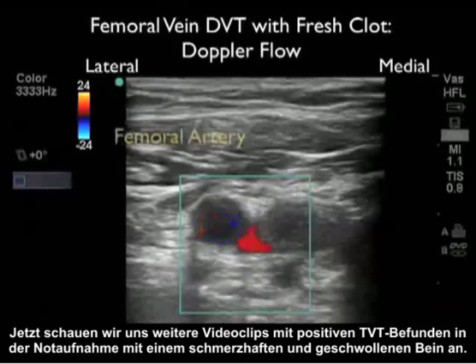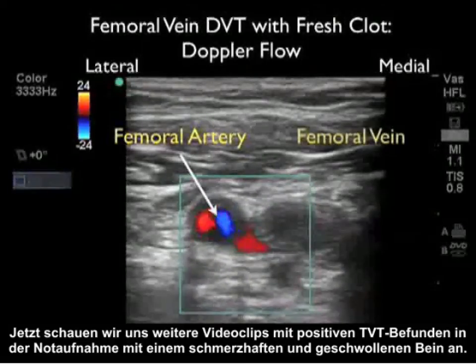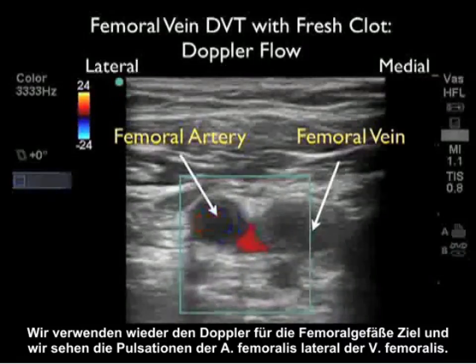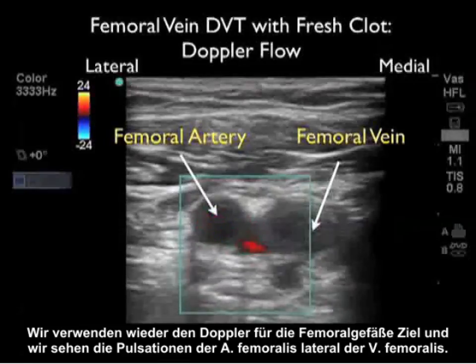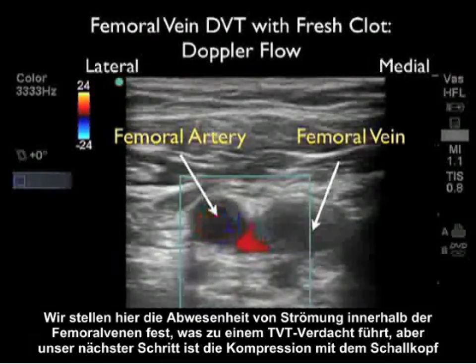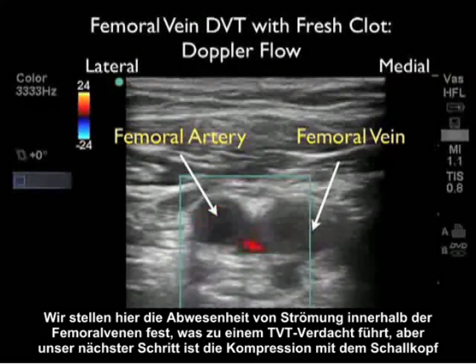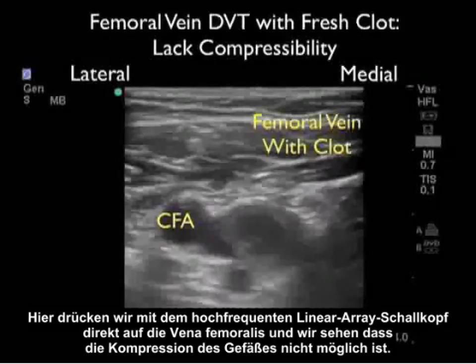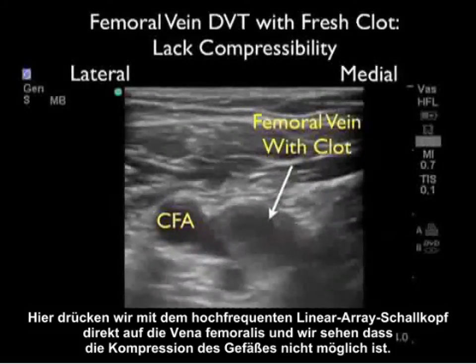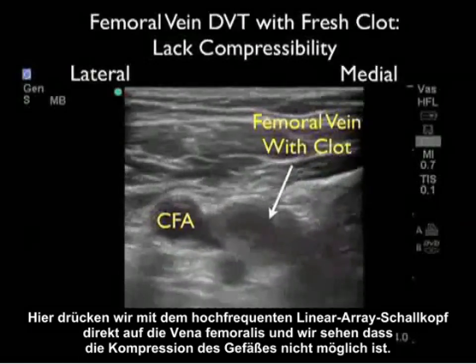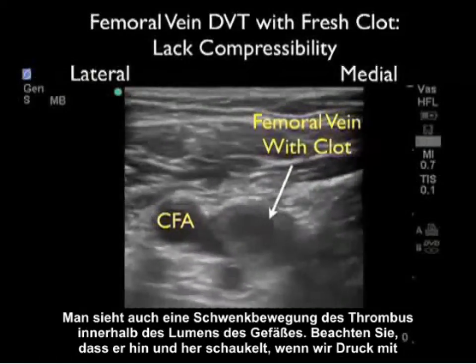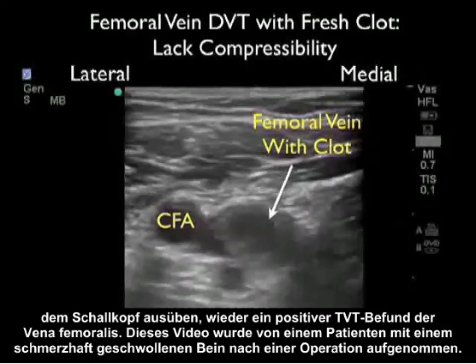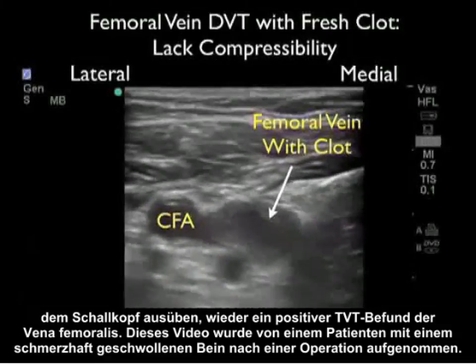Now let's look at another video clip showing a positive DVT in a patient presenting to the emergency department with a painful and swollen leg. We're using Doppler flow again to target the femoral vessels, and we see the pulsations of the femoral artery lateral to the femoral vein. We note the absence of flow within the femoral vein, suspicious for a DVT. Compressing with the high-frequency linear array probe directly onto the femoral vein, we note the failure of compression of the vessel. We can also see a rocking movement of the thrombus within the lumen as we apply pressure — again, a positive finding for a DVT of the femoral vein.